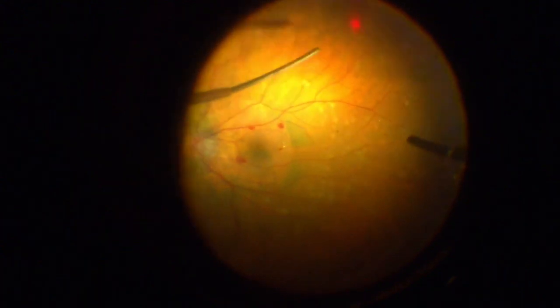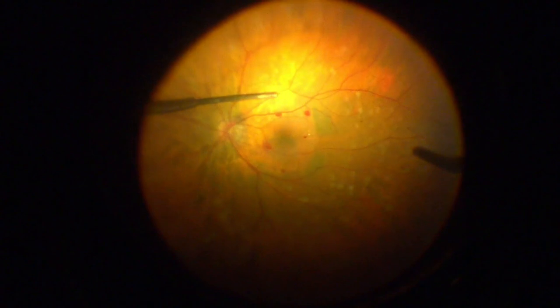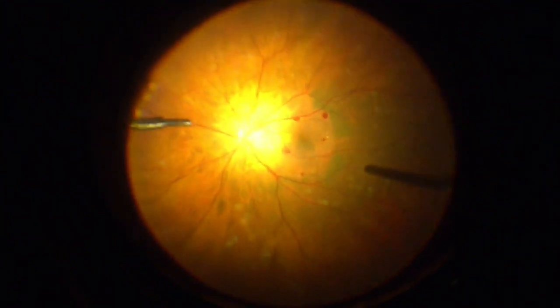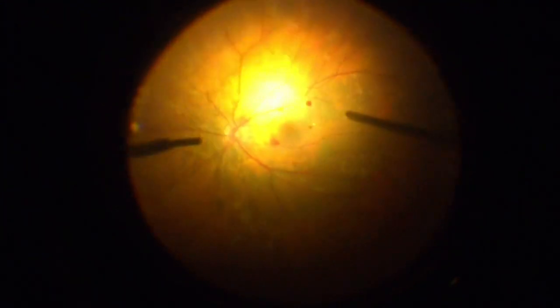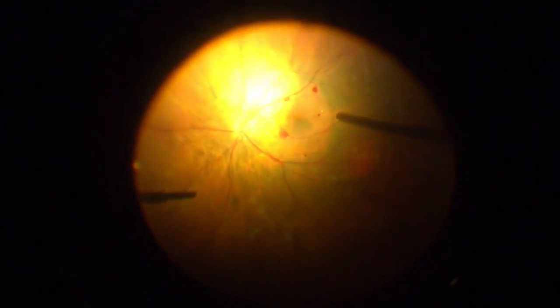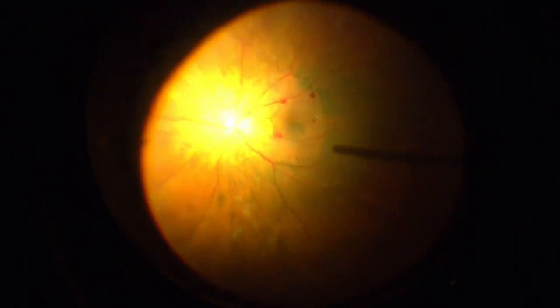And we're almost done. Again, not too heavy. Doesn't have to be contiguous, certainly. What I would consider to be a light or moderate amount of PRP in the periphery is more than fine. So here we are. So now we're looking at the back of the eye. You can see the staining peel area, laser in the standby. And we retract the probe, withdraw the laser.